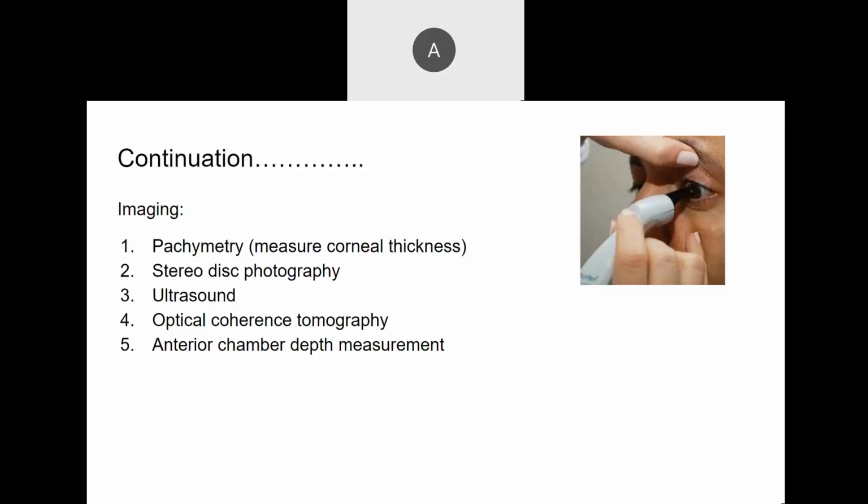Dia boleh measure optic disc dengan optic cup tu, dia boleh measure berapa. And then dia boleh kira fiber mana yang loss ataupun thinning tu dekat which area. Kita boleh document yang tu, boleh support punya diagnosis kita.